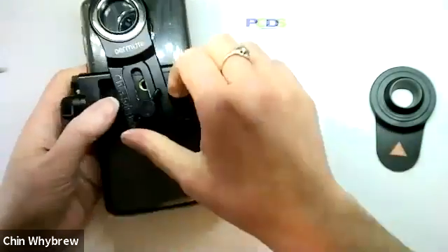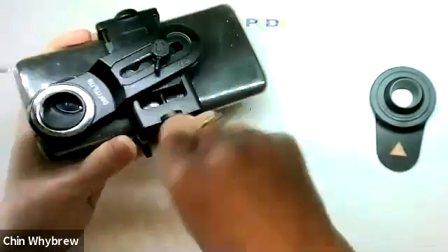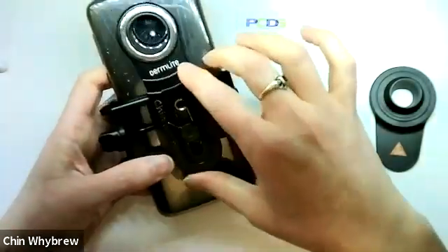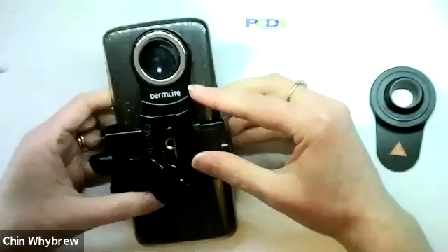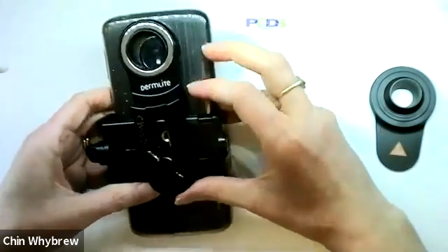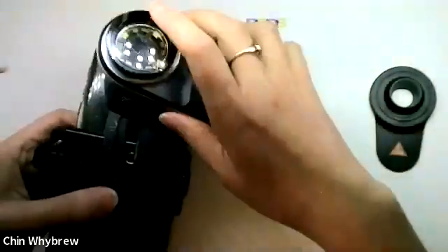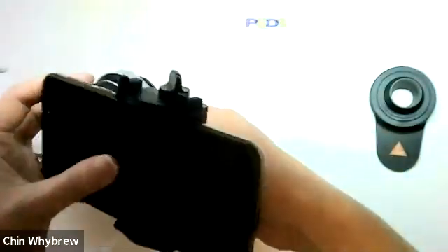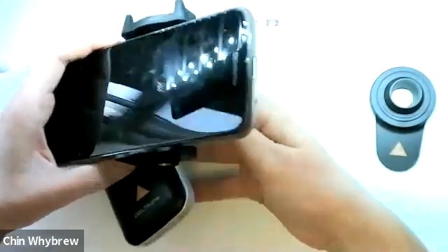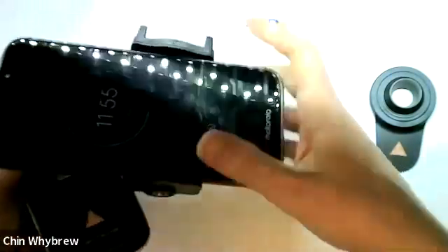It has this bit on the back — you just undo that and that lets you move this around. Now I can move this around to get it over the camera. If you have a phone that has three cameras in the corner, or sometimes even four, the way you line it up is you put it on like this, attach your dermatoscope to it loosely, and put it down on a table or your leg to line up the camera. Once you've got it lined up, tighten up that little screw whilst it's in place, and then you can go and use it on the patient.